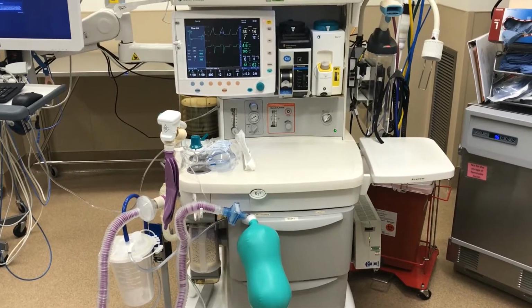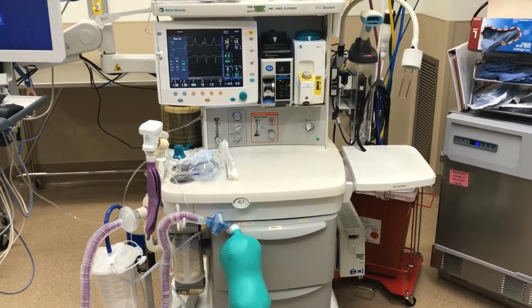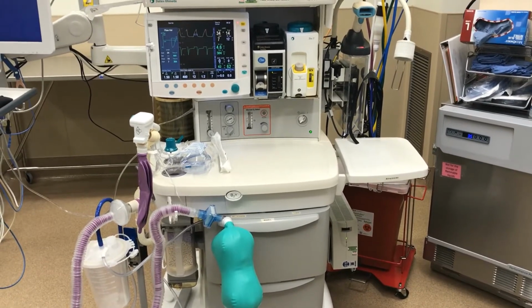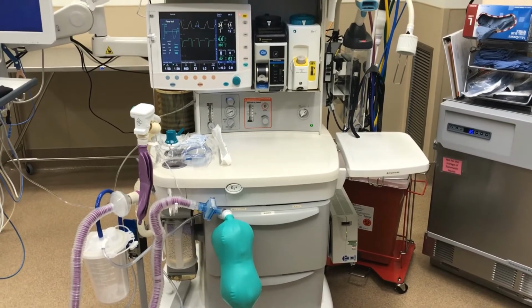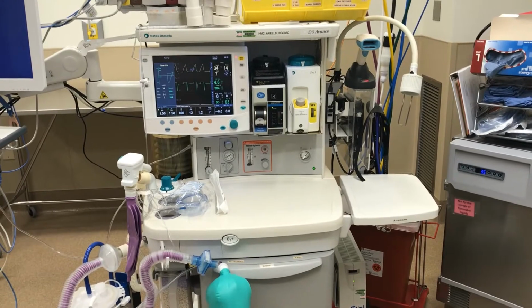Hi, this is Joe Dietrich with Anesthesia, and we're going to talk a little bit about using our anesthesia machines for critical care ventilation. We certainly hope we don't have to go that route, but if we do, they should function very well with a few caveats. We do have two different types of anesthesia machines. The one we're looking at right now are the ones at Hedrick.